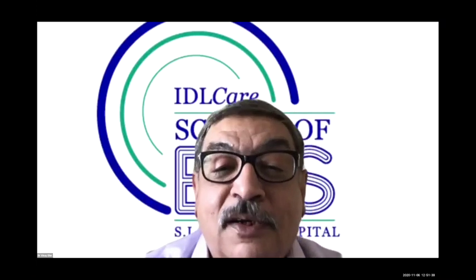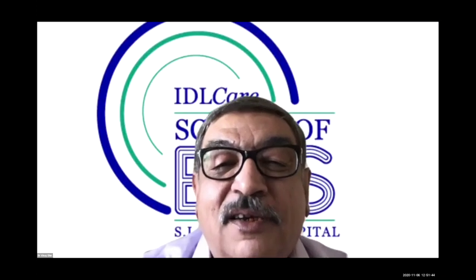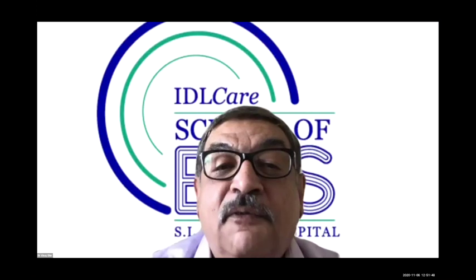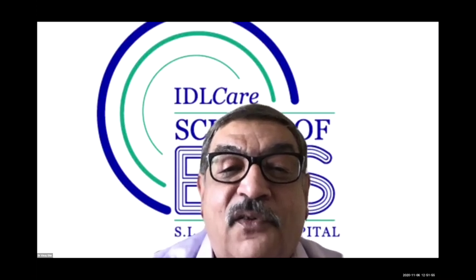I personally have not used Hot Axios in gallbladders. I have not used Hot Spaxus. I believe you need a little stronger stent. Probably Hot Spaxus will work. But Nagi for gallbladders, I will be a little careful.